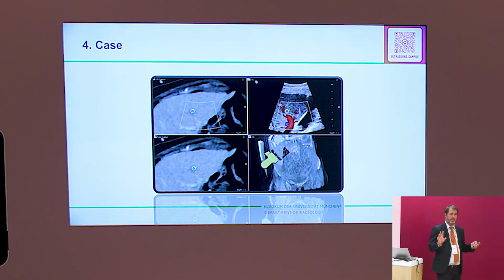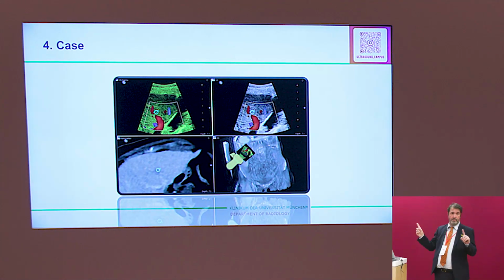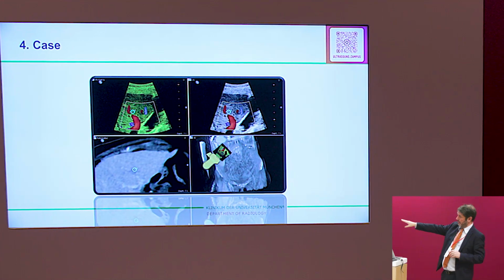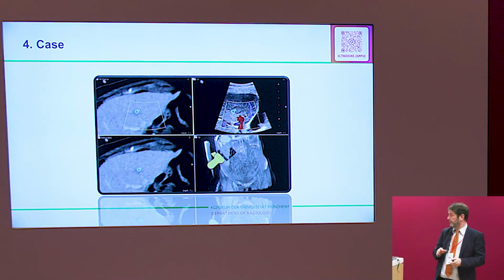I just use different layouts, so you see, I check if I turn the knob, is the plane fine or not. So we see the border of the CT liver looks very similar to the border of the ultrasound liver. So our registration is fine.